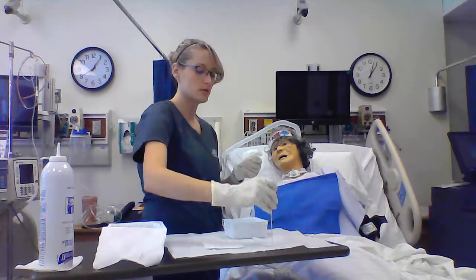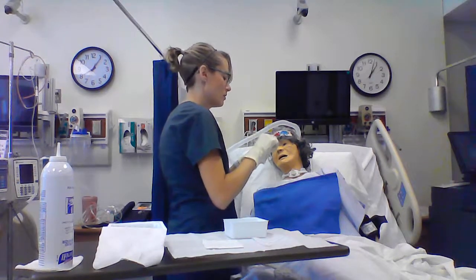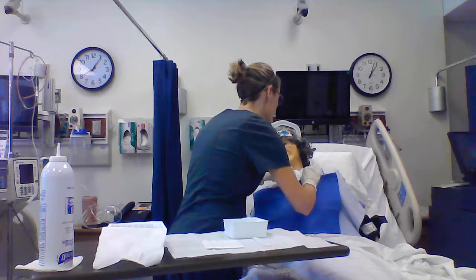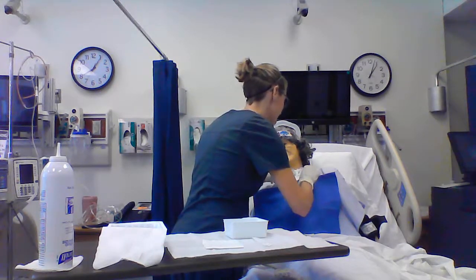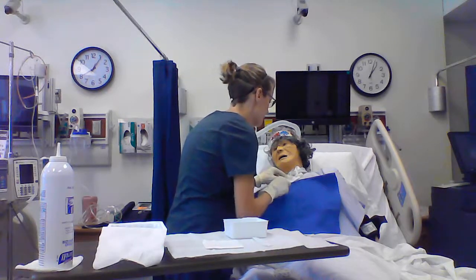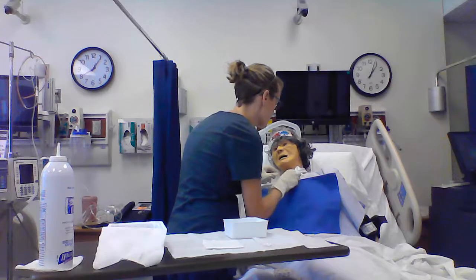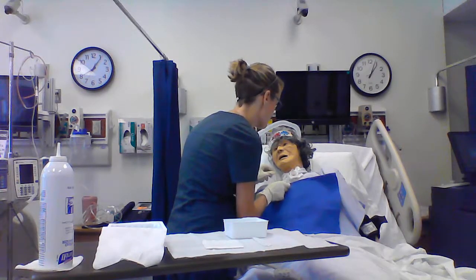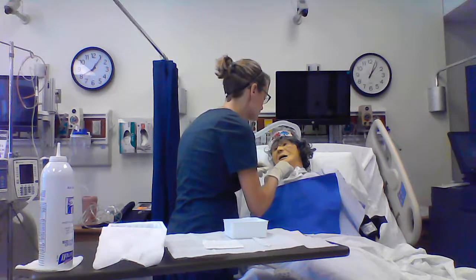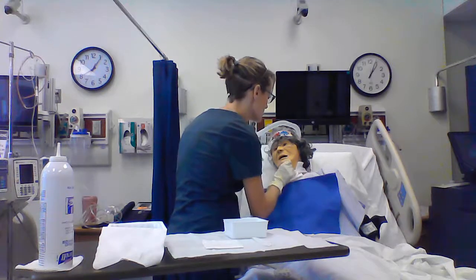You could use sterile surgical clamps for this too to help get this V-sponge up. The long Q-tips are nice. So I'm going to try to stay as sterile as possible, getting this new dressing around her incision site without injuring my patient. And once her V-sponge is up far enough, I'm just going to grab the edge here and pull it so it's secure around that trach.